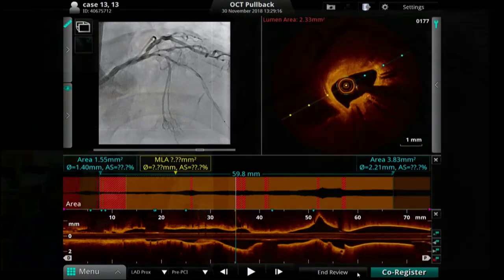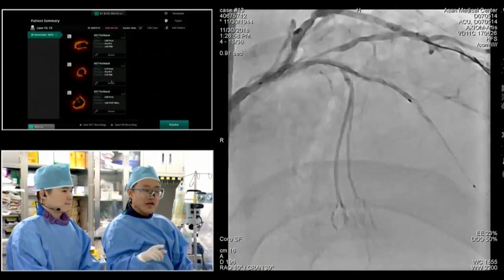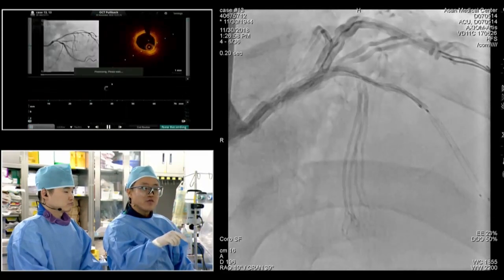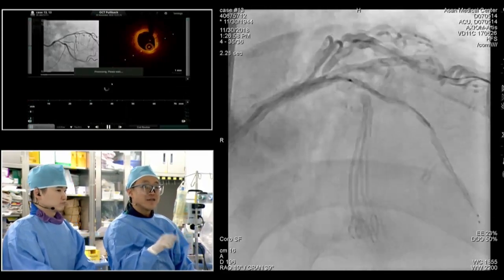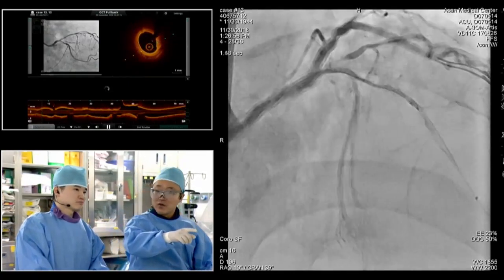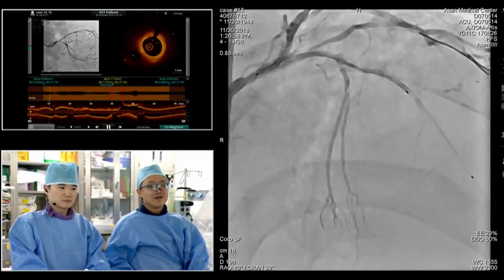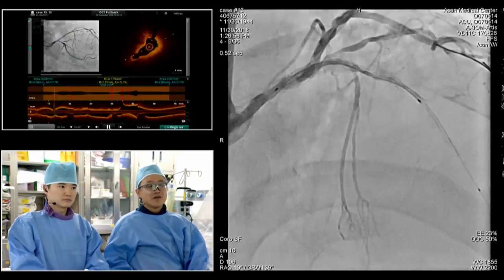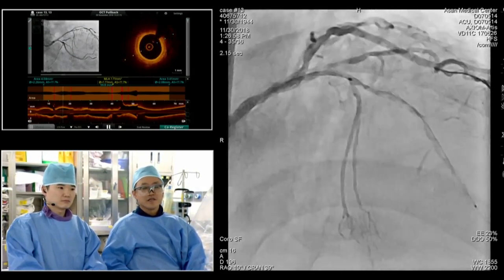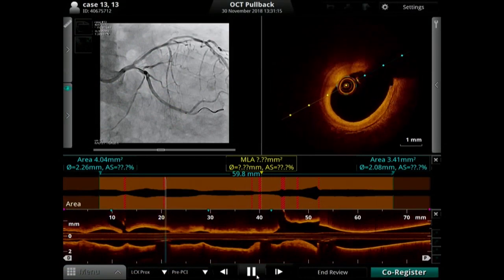In the initial angio, we checked FFR from the mid-LAD to the left main. The FFR dropped down to 0.49, definitely a functionally significant region. At the time, looking at our initial diagram, can you see the diagram? Okay, looking at the FFR value.